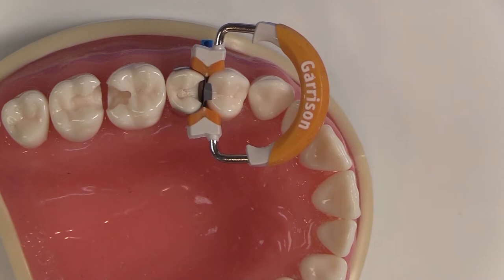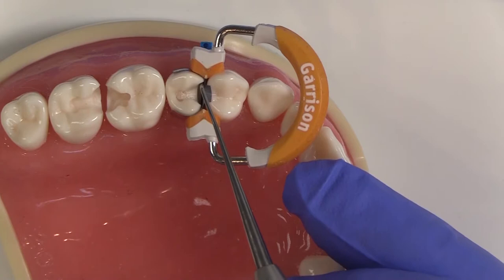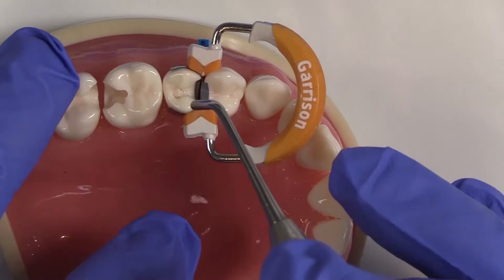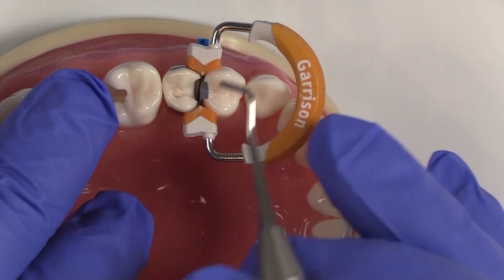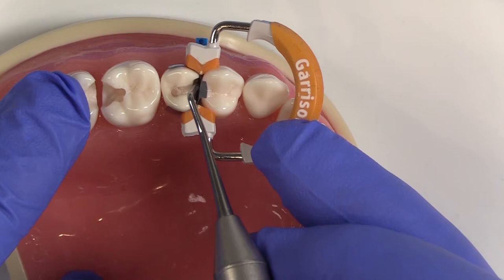That's how I get very minimal finishing and cleanup. I've wedged, placed my matrix band, and selected the right ring — that's really most of the battle. The things you want to avoid are difficulty with cleaning, finishing, and flossing through contacts. Right before I do the actual restoration, I burnish in the contact area, defined about one to two millimeters below the marginal ridge, doing about a two by three millimeter area.